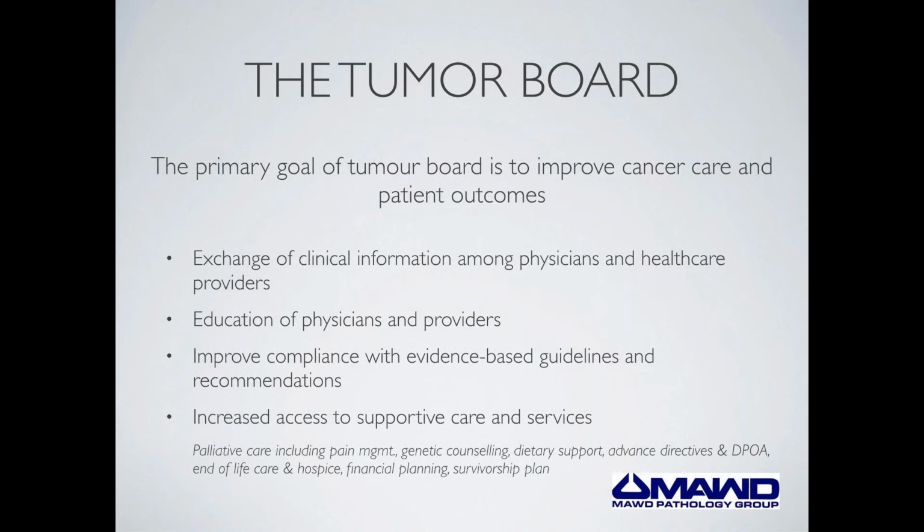Yes, thank you. Okay. Now, at the epicenter of this team approach is the tumor board. The primary goal of the tumor board is to bring together this cancer care team and help improve the care and outcomes of patients with cancer. In my opinion, the primary goal is accomplished by exchange of important clinical information between the members of this team.